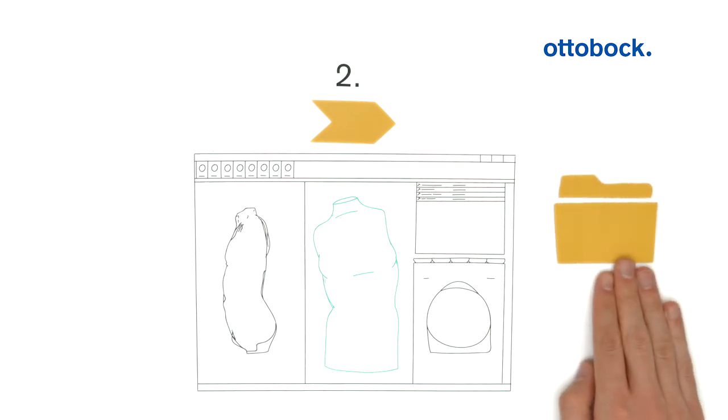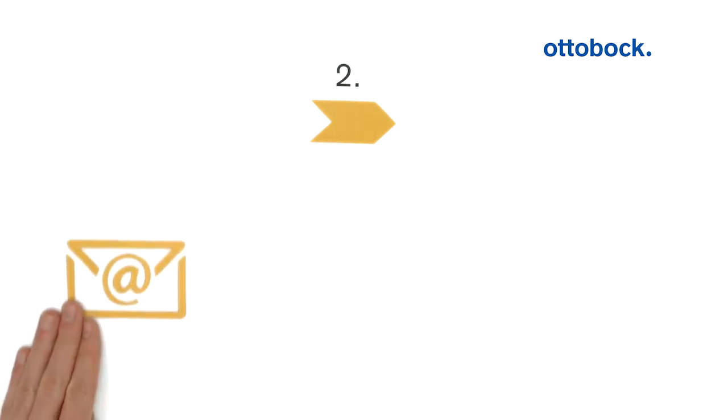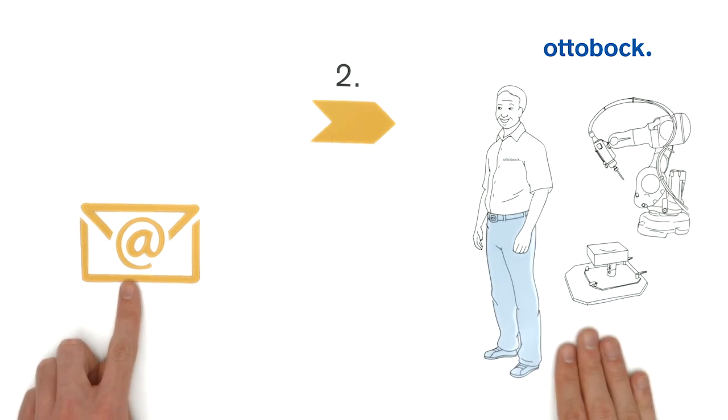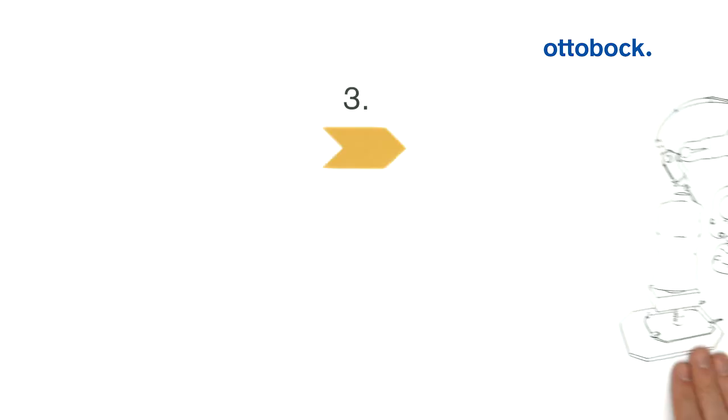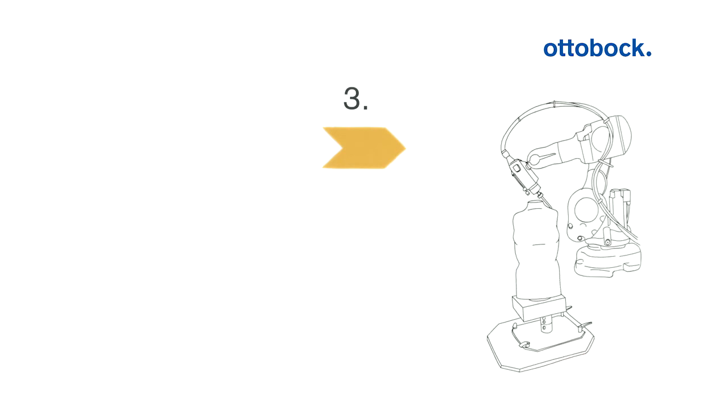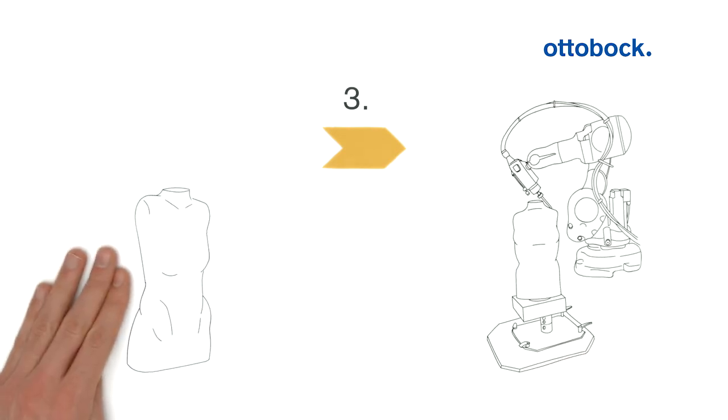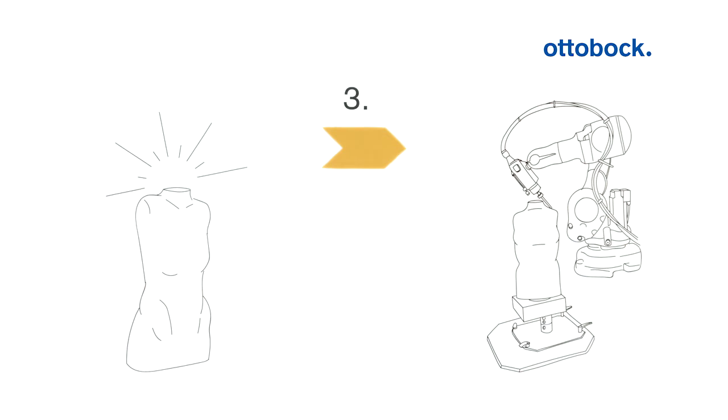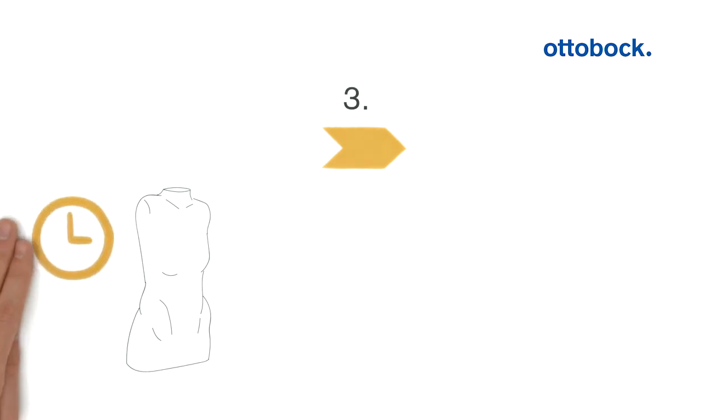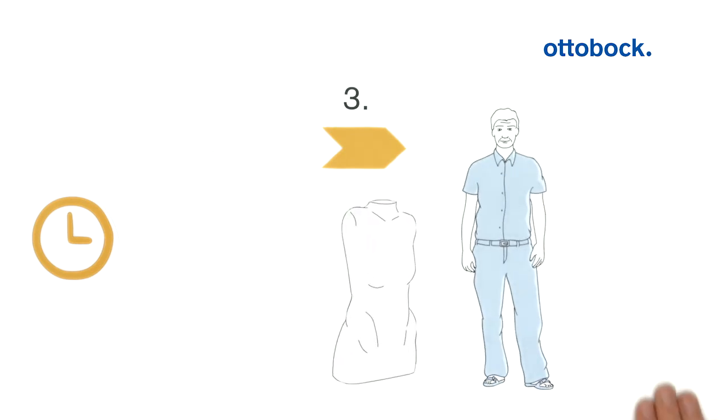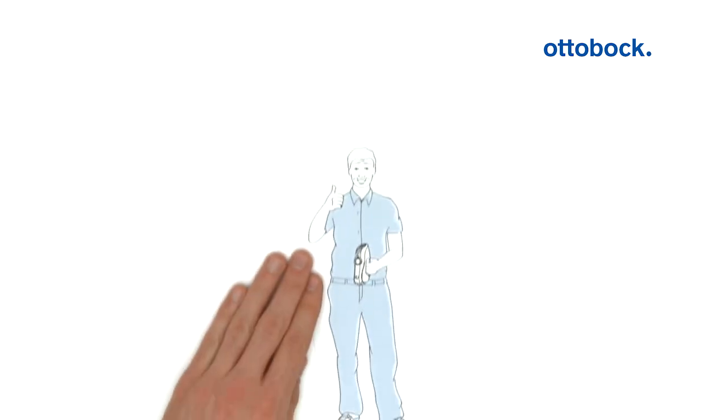Peter exports the finished model data and sends them via email to Ottobock Fabrication. Now here comes the last step: milling the positive model true to the original in usual Ottobock quality. Within the agreed time, the model or the test socket is delivered to Peter.